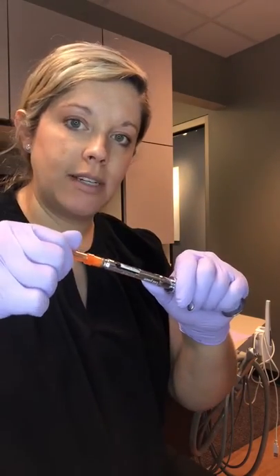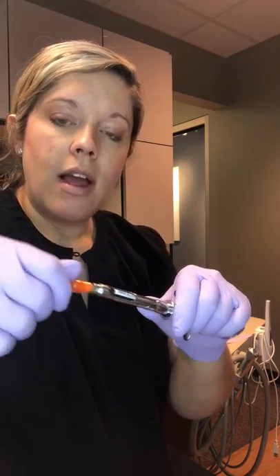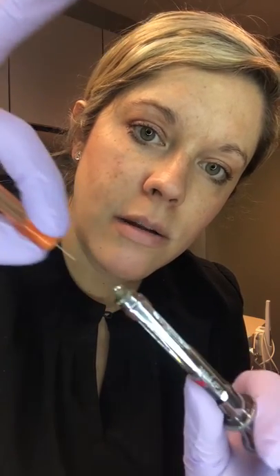So I'm going to press down, turn it towards me. As I can see the thread showing, I'm going to grasp it at the base of the needle and pull straight out.